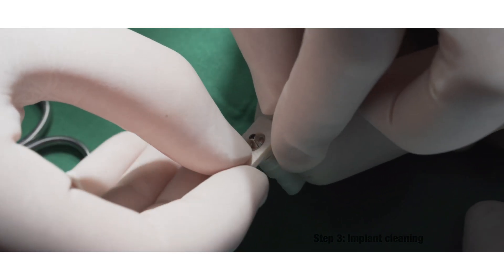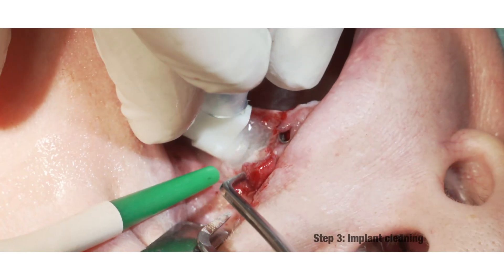Here one can see the electrolytic cleaning of the rest of the threads with GalvoSearch.